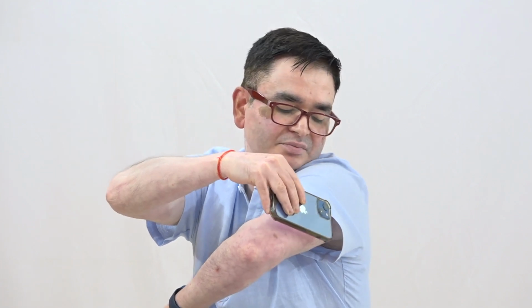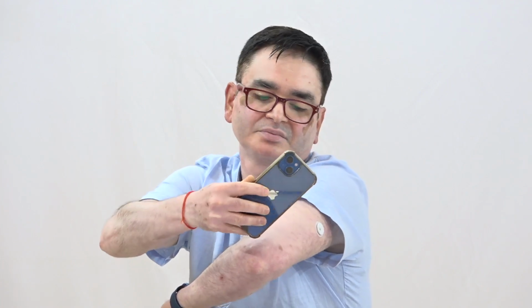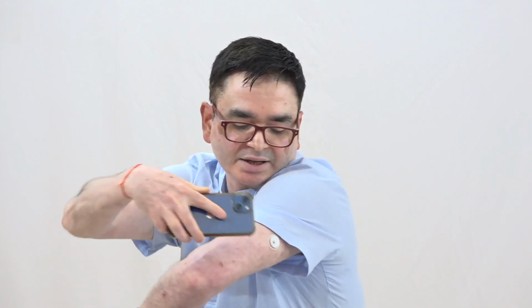It should be scanning the sensor, and then it will start working in 1 hour. There's a warm-up time of 1 hour. There we go. And back, next, scan the sensor.